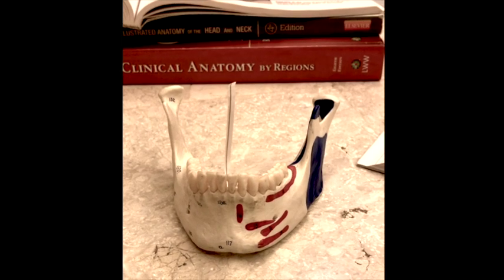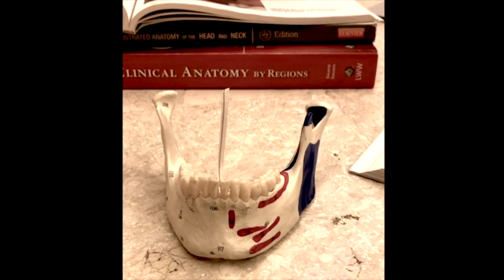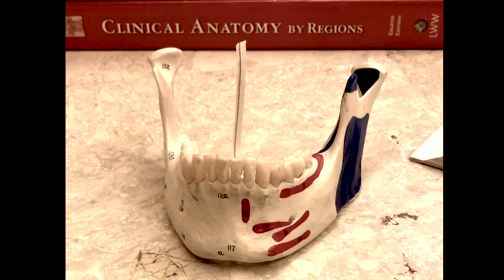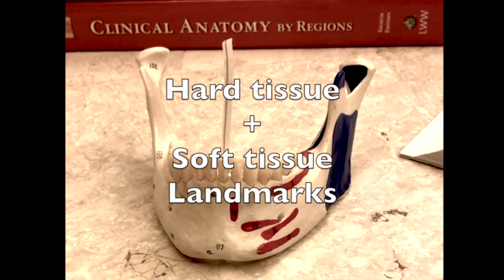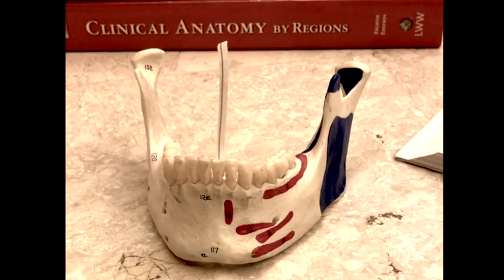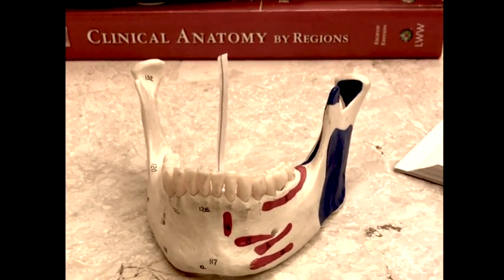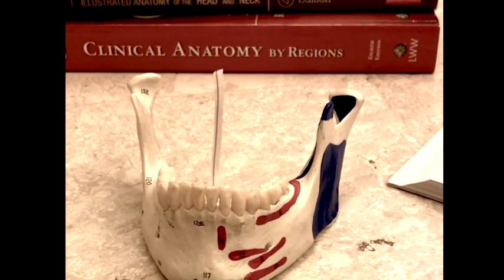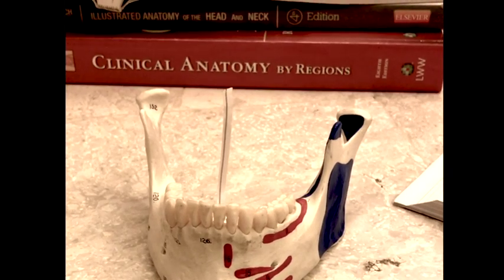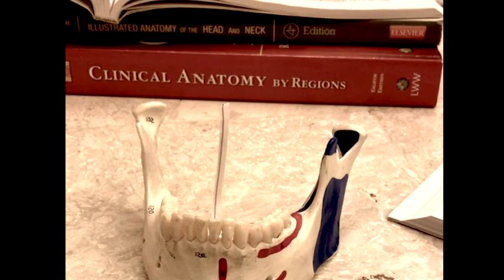In this video you'll learn how to give an inferior alveolar nerve block. We'll start with two anatomical landmarks — hard tissue landmarks and soft tissue landmarks. You need to rely on both because sometimes teeth are missing, and sometimes there is variation in anatomy. By depending on both, you'll most probably be able to deliver successful anesthesia.